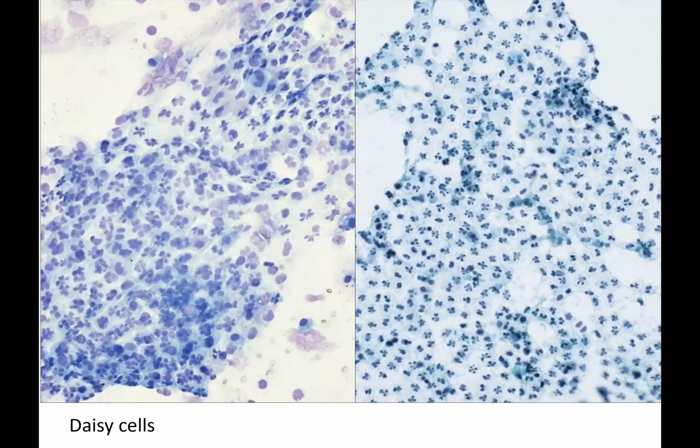And this is a washing sample from a 72-year-old with benign serous cystadenoma and pelvic inflammation. And the washings had a rather grubby background to them. And you can see that in the sheets of mesothelial cells, the nuclei have a very interesting lobulated appearance. And this lobulated appearance is the so-called daisy cells. It's a benign reactive phenomenon.